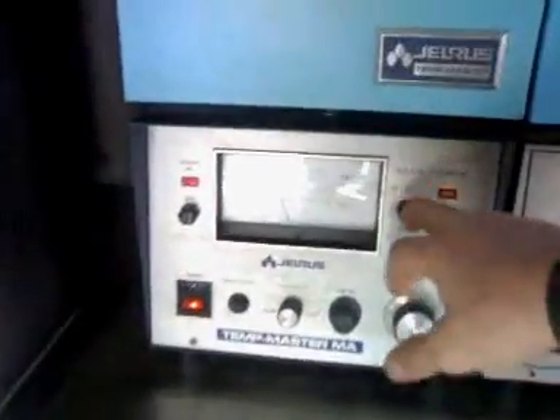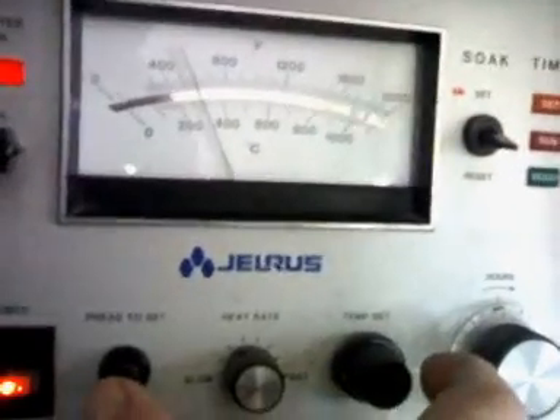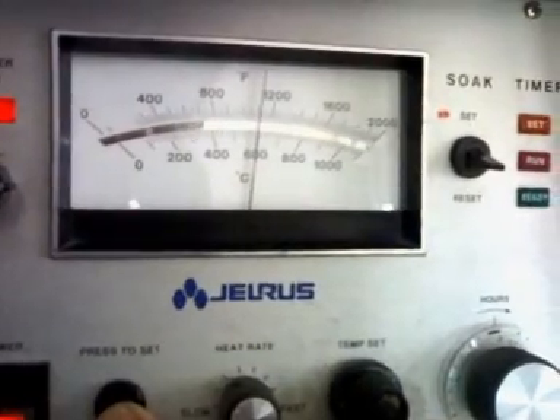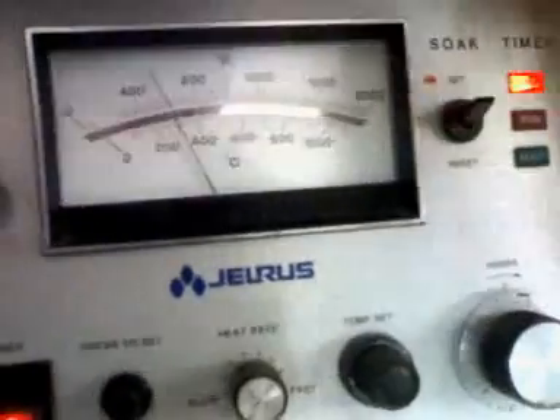We have now reached temperature. We can get our tongs and we can actually see that our ring has started to burn out — it's still warm. Now we just bring our temperature up. We're going to set it at 600 degrees, 15 minutes this time. And that's it — set for the next stage.